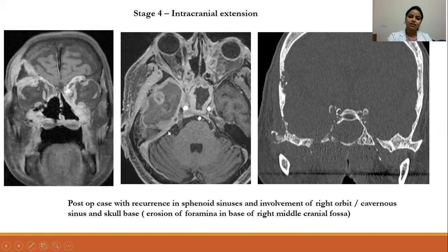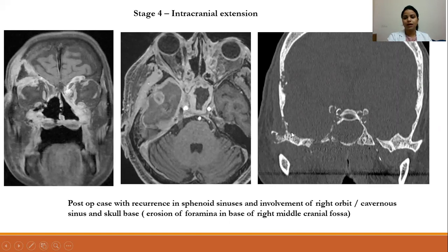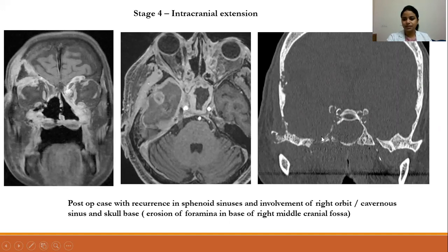Disease was also seen involving the meninges, with meningeal thickening and an abscess in the right temporal lobe. On CT, there was involvement of the frontal bone and sphenoid sinus.